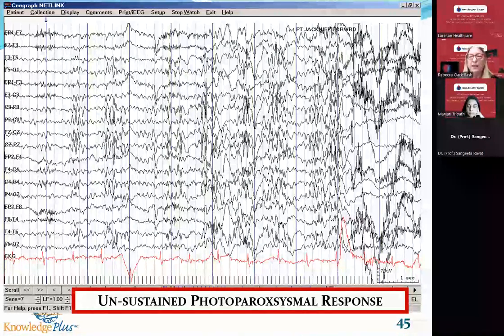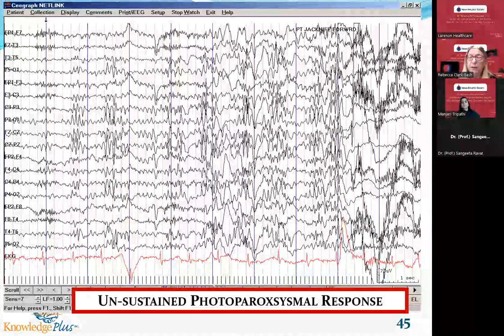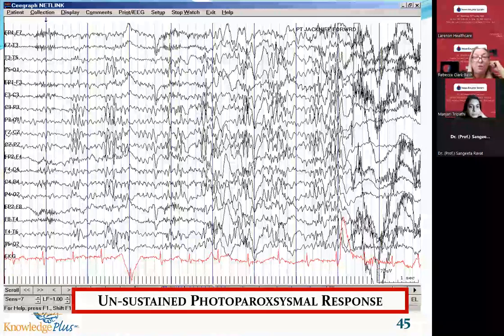So we go in there. It's this prisoner, and he's in this chair that reclines back. His hands and feet are still bound. And that's the most dangerous part about what happened next. So the tech goes in, she starts, and by the way, it looks like he has some very high amplitude posterior dominant rhythm, as you see here, and starts in second two, three, and then it becomes more generalized in the middle of the page.